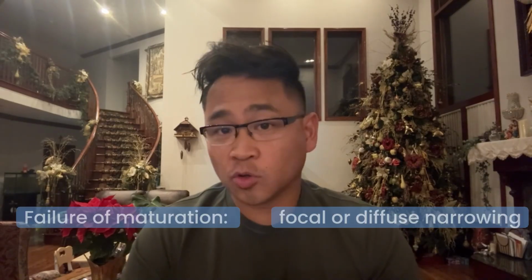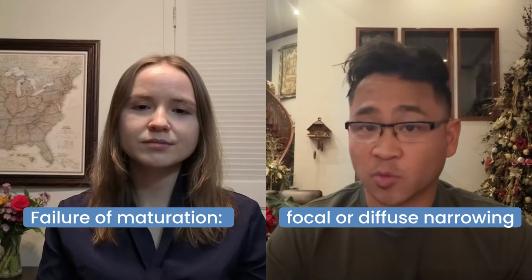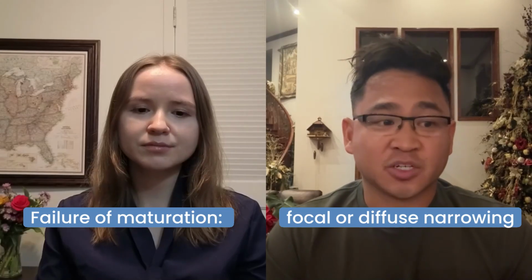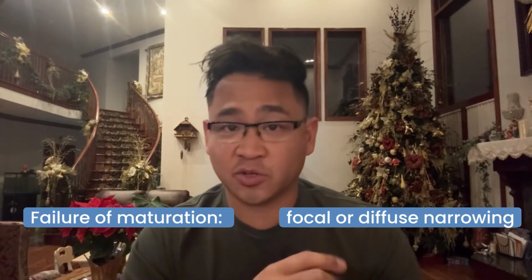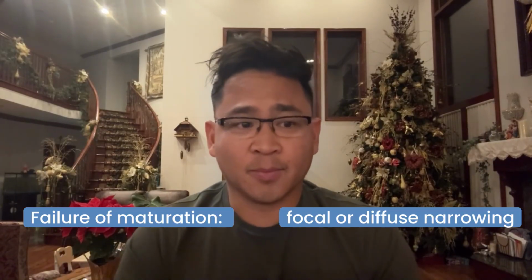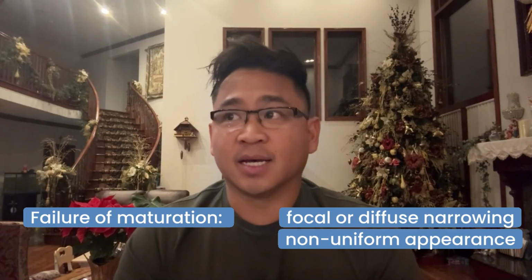That's very helpful. So, how do you identify if there's a failure of maturation? How does it look? Failure of maturation for a fistula tends to happen in designated areas more often than not. So, what you would look for is either focal or diffuse narrowing, which is not the typical tubular appearance of a fistula you'd like to see. It's very raggedy and non uniform.